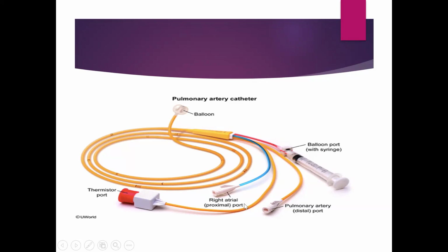At the beginning, you have to connect your pressure transducer at insertion, so that as you pass through the different parts of the heart, you can see the different pressures being displayed. It helps to tell you which part of the heart you are in.